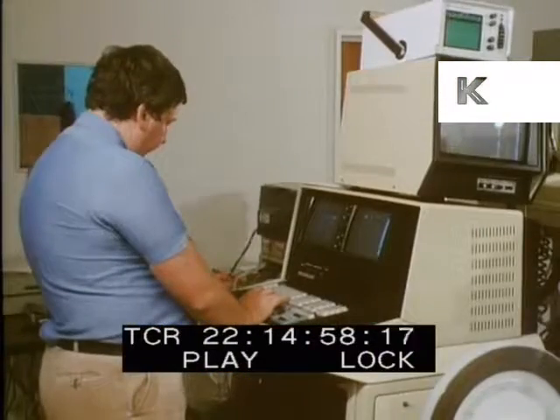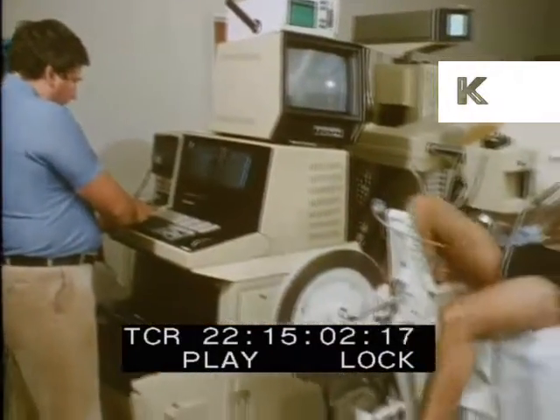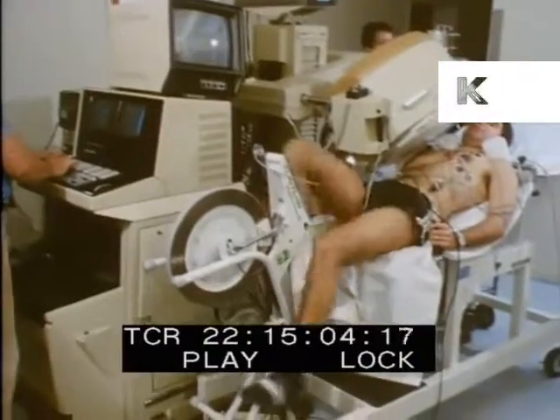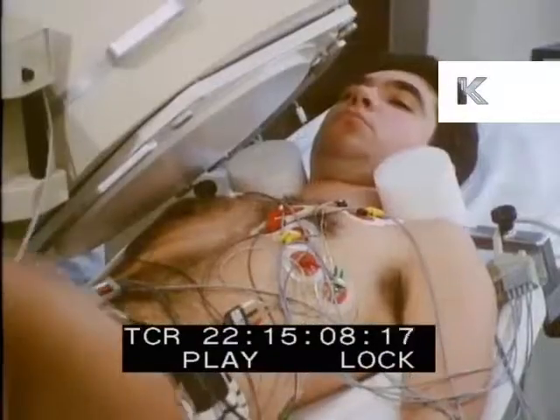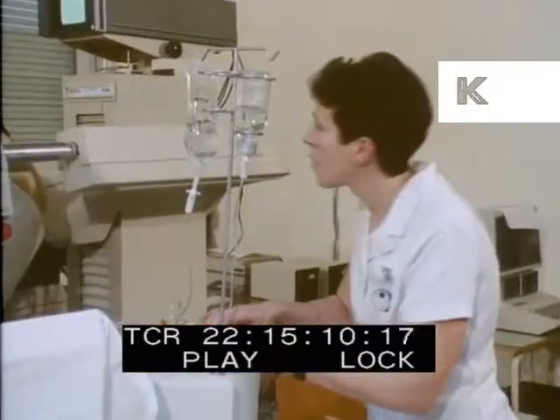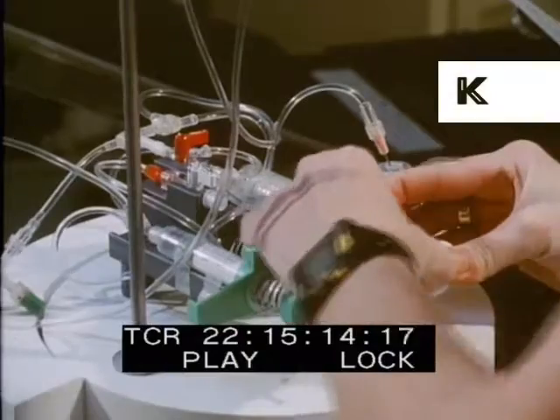The advantage of this technique is that the life of the radioactive gold is short, about 40 seconds. But unlike other radioactive isotopes, it rapidly transforms to harmless products in the body. It is therefore possible to make multiple first-pass studies.